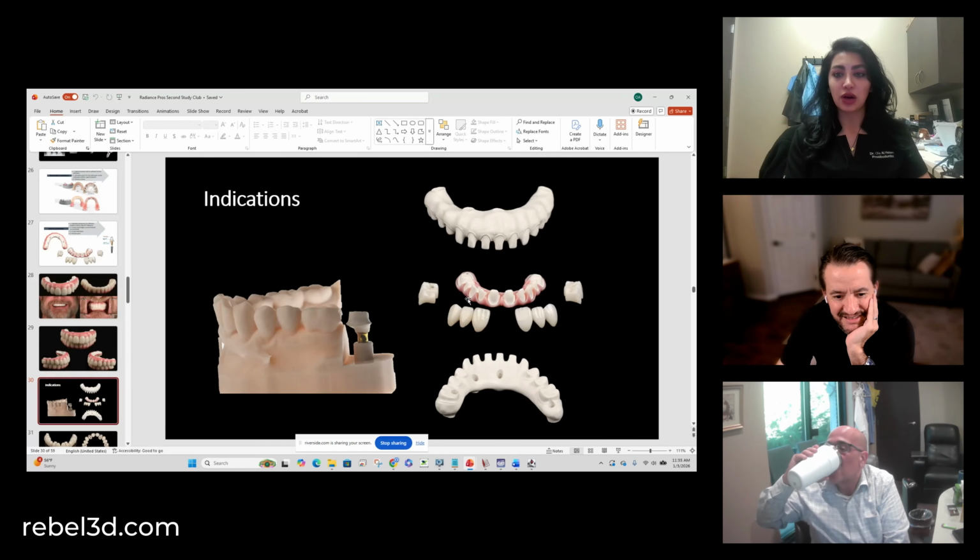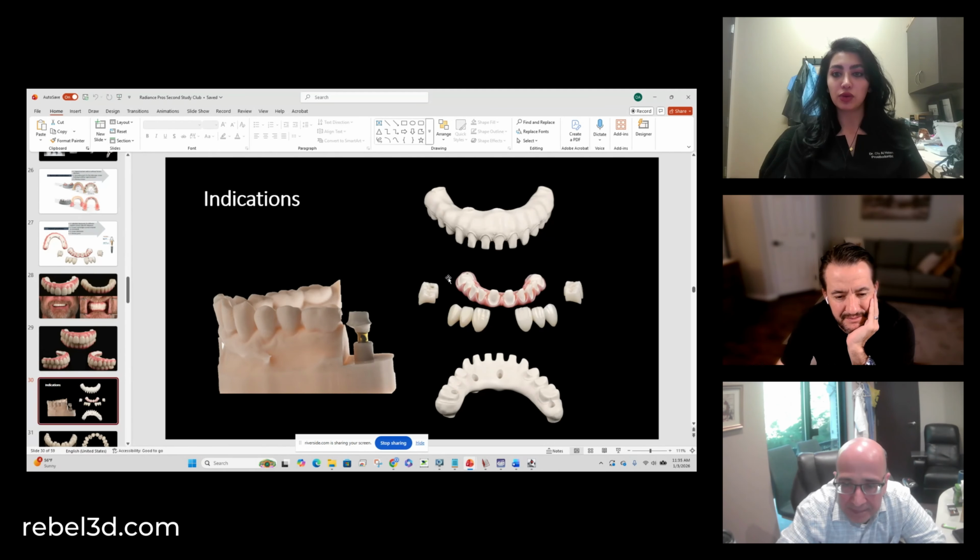Then you can see here how the separate zirconia bridges get cemented on top of that thimble bar with the composite in between. And like Dr. Iskandar was saying, you can really customize the color of the gum. That comes from those really nice pre-op pictures with the retracted photos, so the technicians can see the color of the gums and match it perfectly.